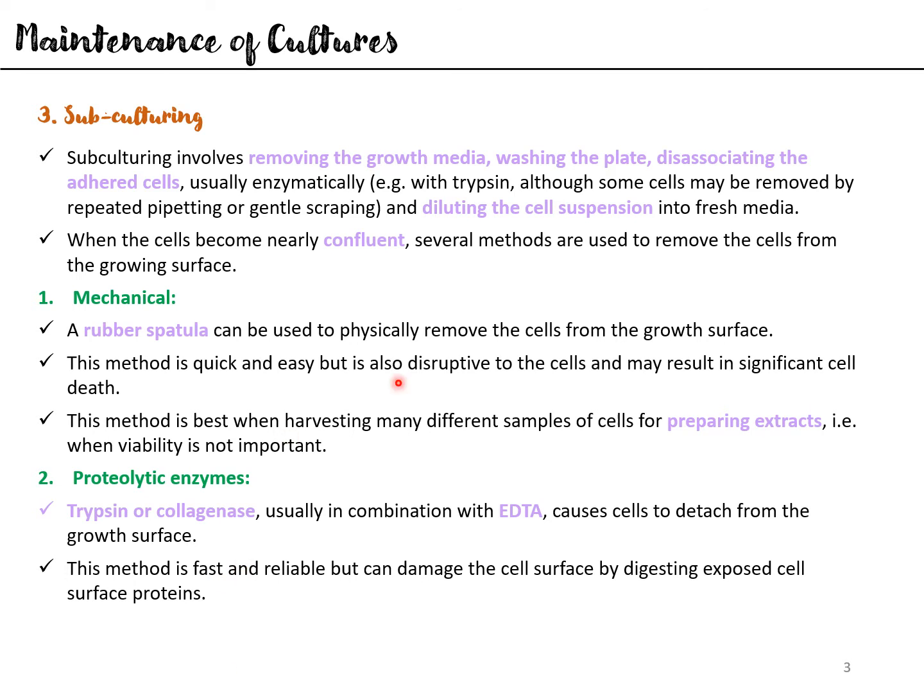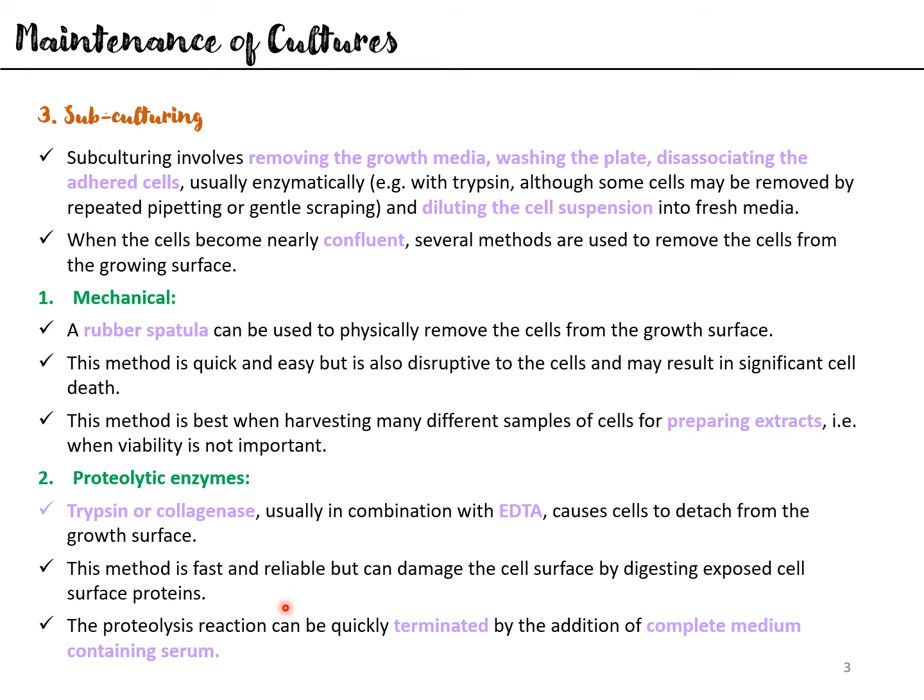That is why, after you remove the media, you wash the plate, because this ensures that any residual media is removed. So the trypsin, once added, will not be immediately inactivated. It can serve its purpose, and then to quench the reaction and stop excessive trypsin digestion, you add media containing serum.